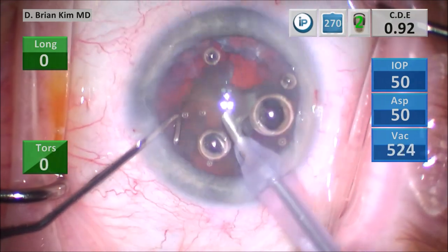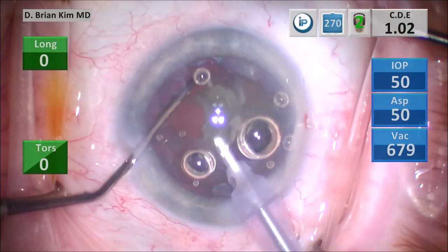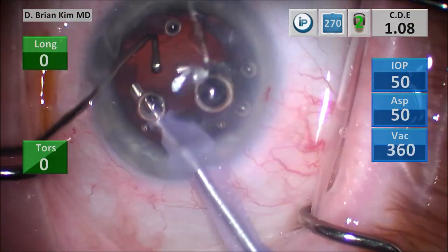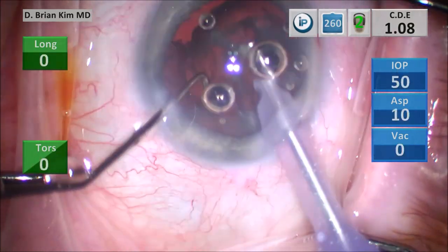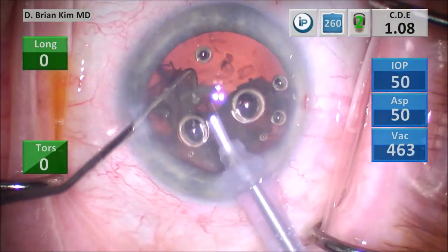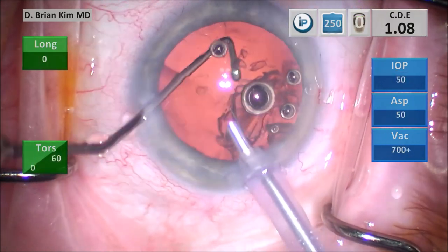I use high vacuum to prolapse that fourth quadrant up, and then I'm able to chop it by placing the chopper around the lens piece and crushing it against the phaco tip. I'm using mechanical fracturing forces — using the chopper to crush the lens against the phaco tip, using high vacuum and some ultrasonic energy. I'm trying to find the edge of the epinuclear shell with the phaco tip, and as I do this, I'm able to get around the epinucleus with the chopper, which helps loosen the epinuclear material. You can see that despite good hydrodissection, this epinucleus, as well as the endonucleus, just didn't want to come out.